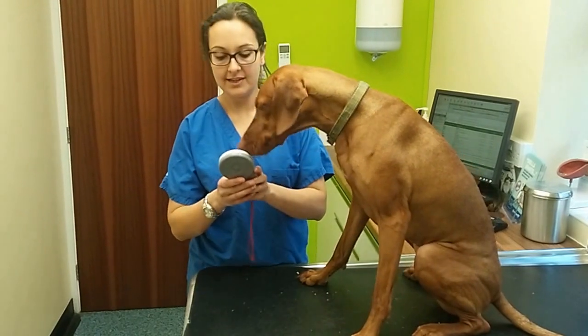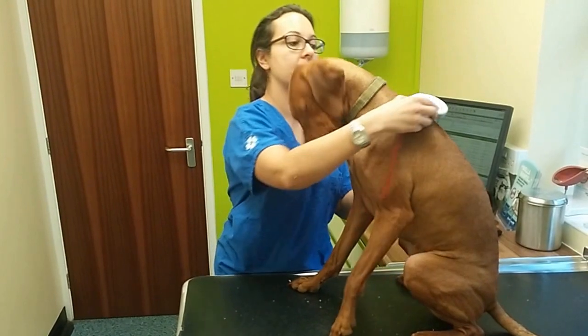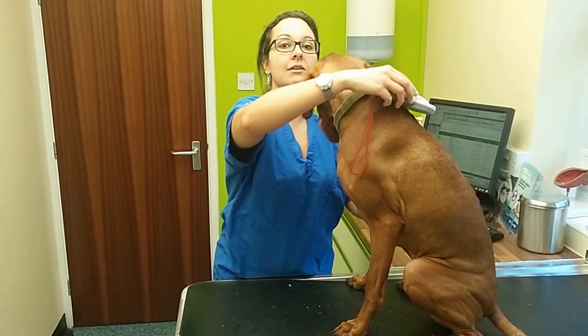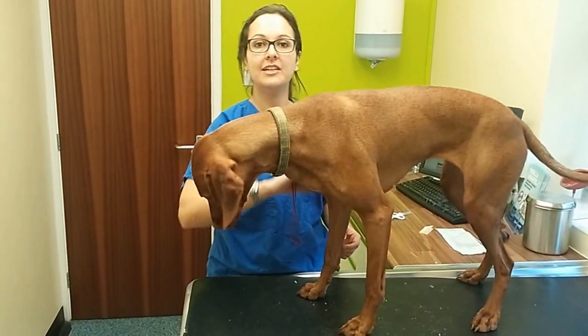Each place has a special scanner, like so, and what they'll do is just scan your pet for a chip, which is usually across the back in between the shoulders. However, they do move — and Ruby's is in fact by her elbow here.